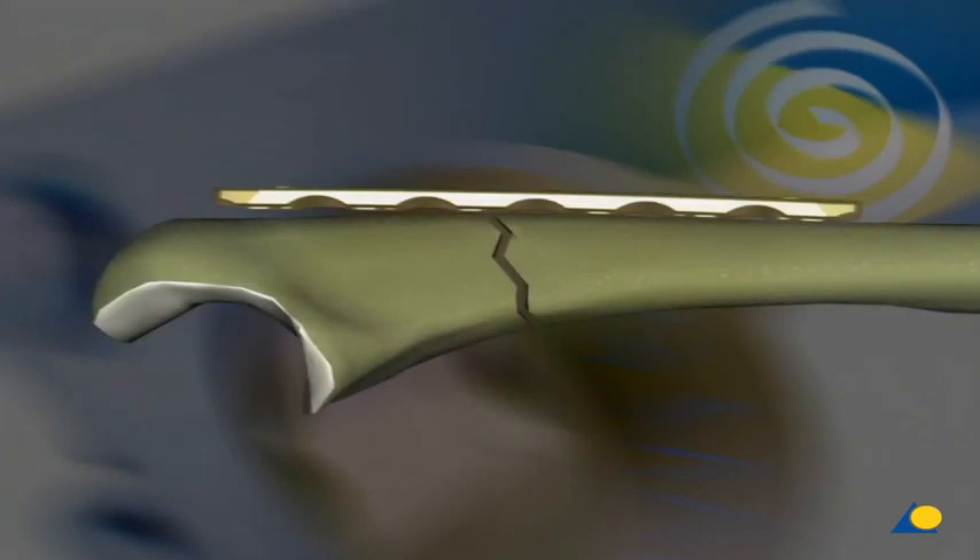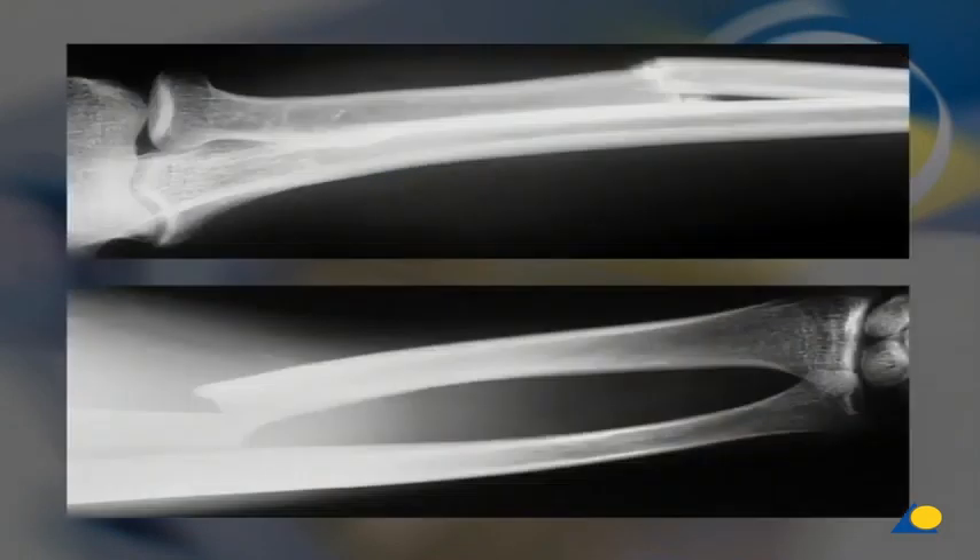Use of the LCP in the combination technique. In many situations, the combined use of standard and locking head screws provides advantages. In simple juxta-articular fractures, the joint block can be fixed primarily by using a few locking head screws. After the reduction through the plate, dynamic compression can be applied to the fracture by inserting a standard screw in an eccentrically drilled hole. The insertion of two self-drilling screws concludes the internal fixation.